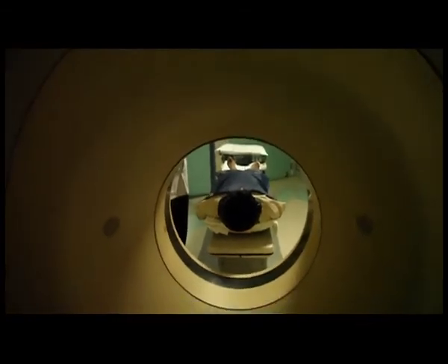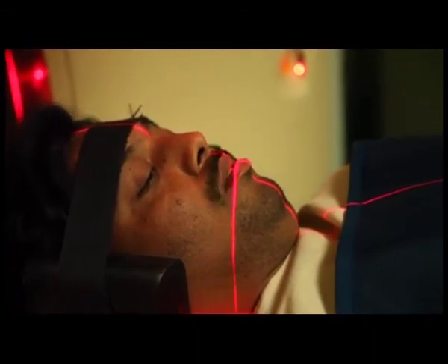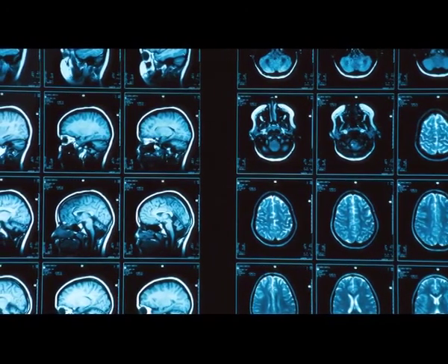As the X-ray tube rotates around your body, the table slowly moves into the gantry. While the table is moving, you need to hold your breath to avoid blurring the images. You may hear clinking and whirring noises. Each rotation gives several images or thin slices of your body.